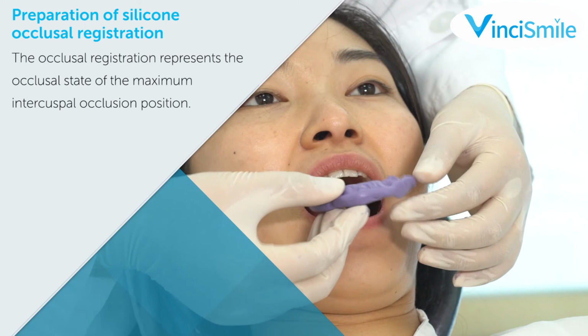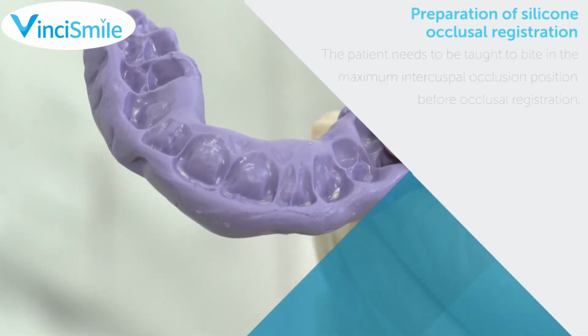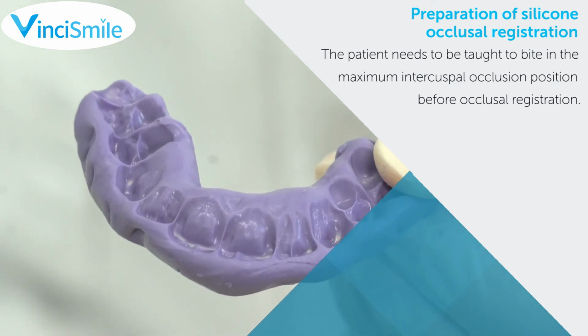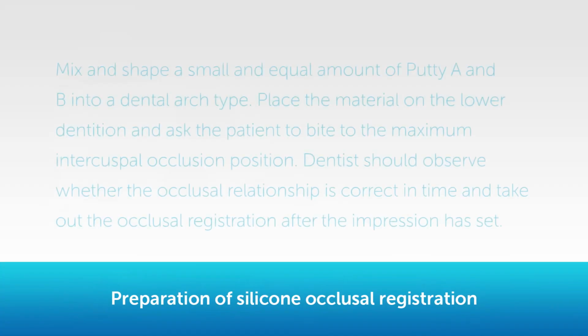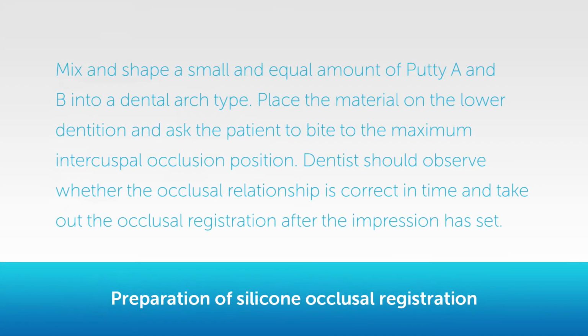The occlusal registration represents the occlusal state of the maximum intercuspal occlusion position. The patient needs to be taught to bite in the maximum intercuspal occlusion position before occlusal registration. Mix and shape a small and equal amount of putty A and B into a dental arch type. Place the material on the lower dentition and ask the patient to bite to the maximum intercuspal occlusion position. Dentists should observe whether the occlusal relationship is correct in time and take out the occlusal registration after the impression has set.